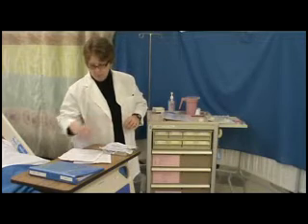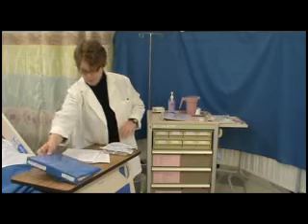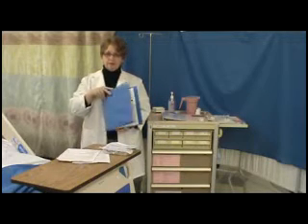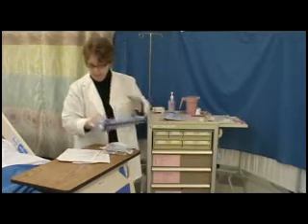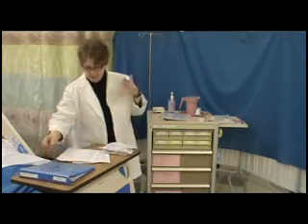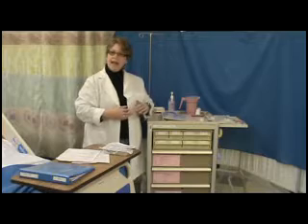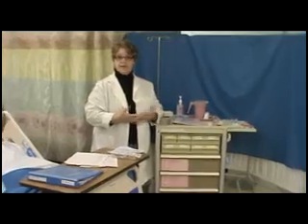Okay, now, as per usual, step one is that you're going to verify the physician's order for accuracy. You'll choose the patient's chart, and you'll go in and choose the IV solution and the secondary solution. Then check all the right patient name, patient drug, time, allergies. At point number 3, where it says verify IV access, it's going to be fine for you to say, this is my patient, and I know that the IV access exists.